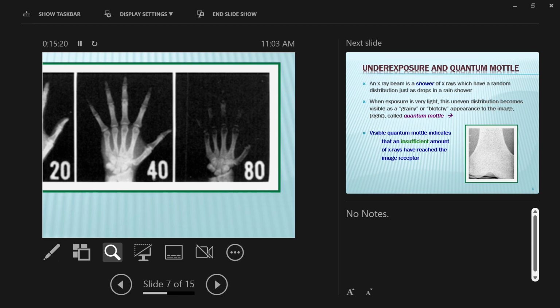And at this extreme end, recognizability is also affected, right? I can't recognize the fingers if they're not visible. Something has to be visible to be recognizable. So at extreme ends, mAs affects recognizability, not by changing the shape or size of anything, which is typically what we think of as recognizability, but by not making it visible to you, because it's blacked out.